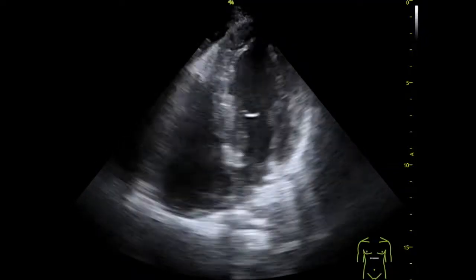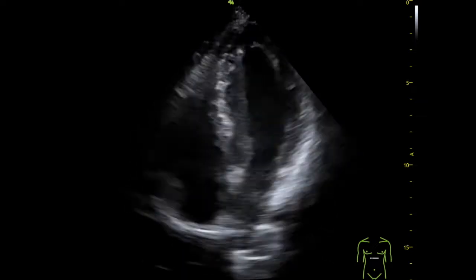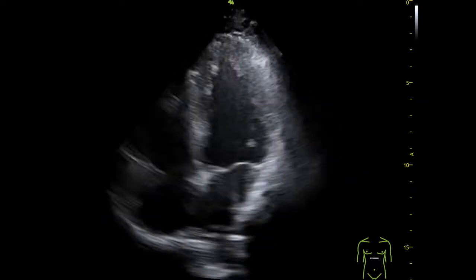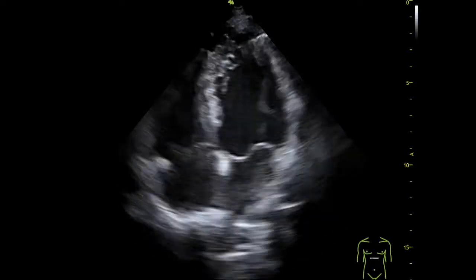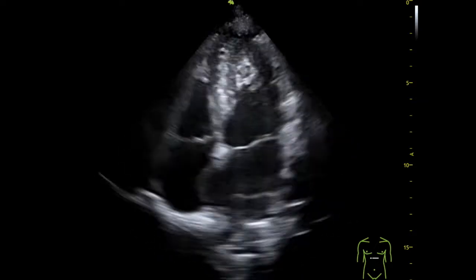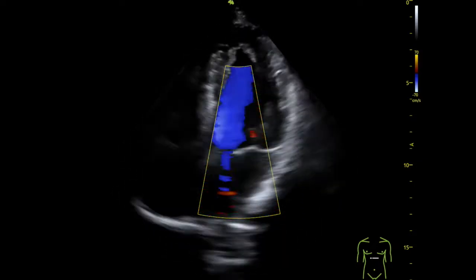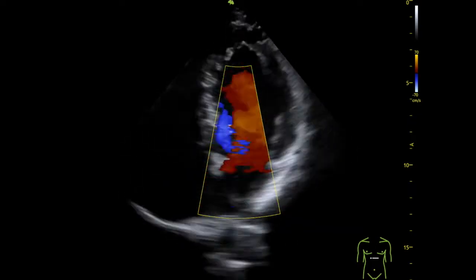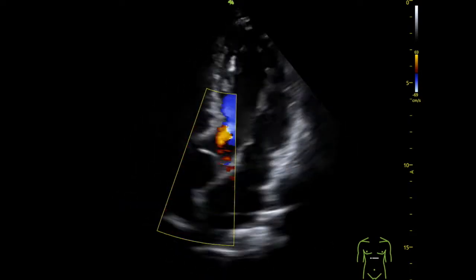Now let's move to image quality. You're going to see some recorded clips with the device for you to assess them and obtain your own conclusions. Let's start with this apical 4-chamber. All these apical 4-chamber views are from the same patient and as you can see it has great image quality. Here we can see the apical 4-chamber with color Doppler — I think the color Doppler of this device is really good for a handheld device. Not many devices have this level of precision and color scale.